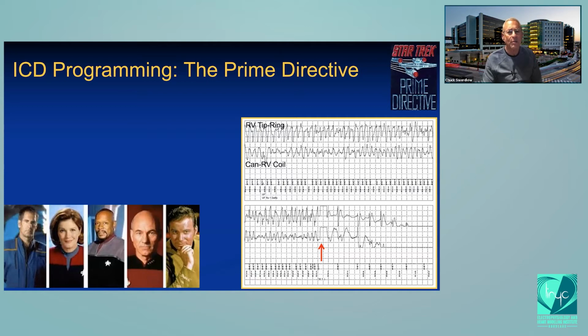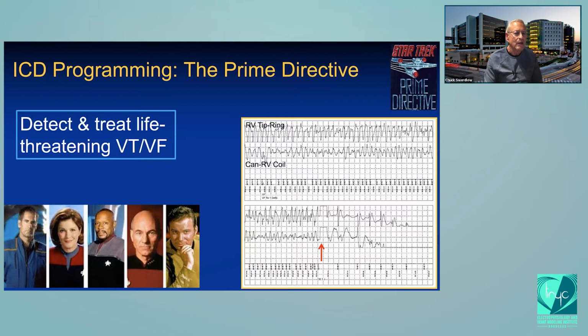Now, I also know Dr. Pillow talked to you a little bit about programming, but let me give you, from a technology perspective, my high-level view about that. So the prime directive, from our TV show Star Trek, of defibrillator programming is to detect and treat life-threatening VT and VF accurately. If we don't do that, nothing else matters.